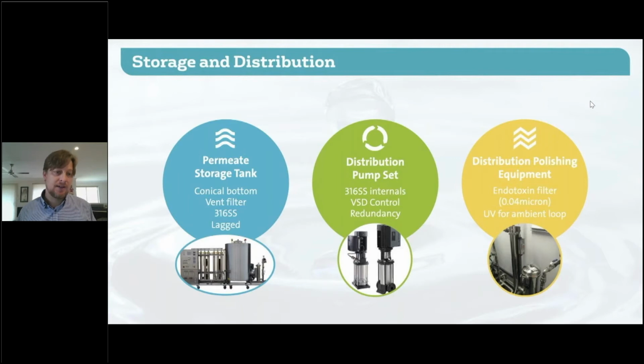Typically that means it's going to be a 316 stainless steel, and if you're using heat sanitization, which in most cases you will be, the tank needs to be lagged to enable you to get the water to temperature and maintain it at temperature for the appropriate amount of time.